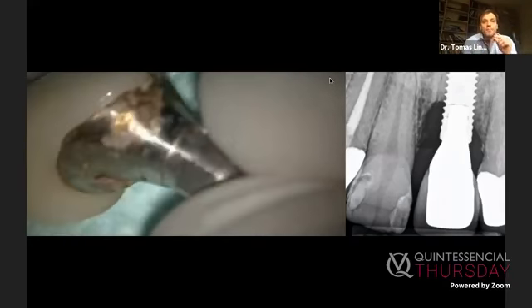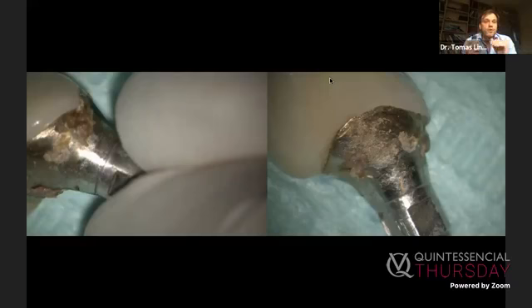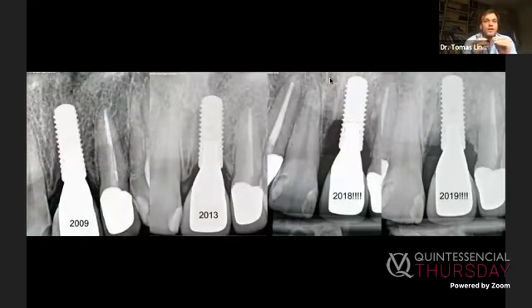Oh, cement happened. When we remove the restoration, you can see the particles of cement glued to the surface of the individual golden abutment. And also you can see the surface of the abutment itself. So we can talk about cement and also tissue smoothness, material smoothness here, because those factors are important in developing peri-implantitis. So that's why I think that cement or screw-retained is an important factor, and selecting cement or screw-retained restorations is the first thing we should do.